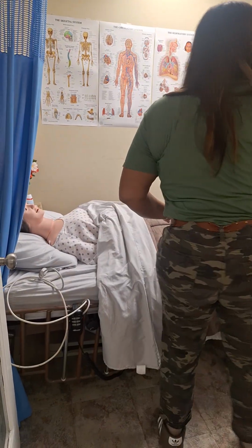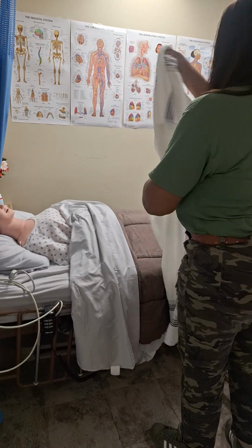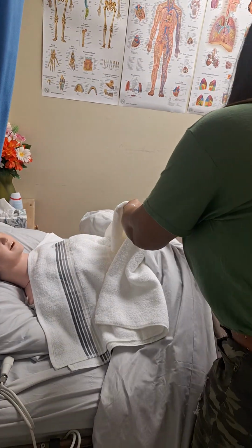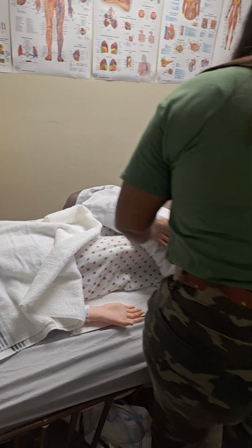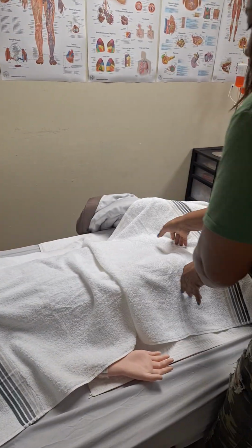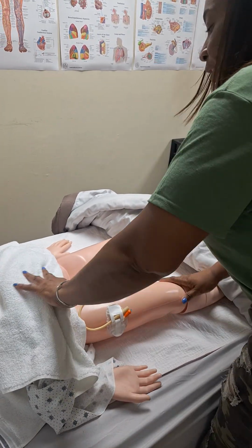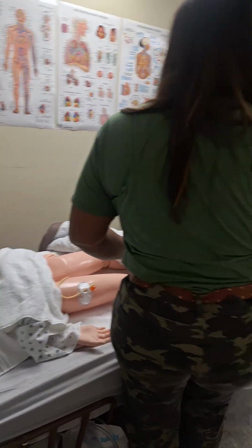So I'm going to put a warming barrier over Miss Allen. The first thing I'm going to do is cover Miss Allen up with a warming blanket. So I'm going to put the blanket over Miss Allen. I'm going to fan fold this down, only exposing what I'm going to wash. So I'm going to wash this, and I'm going to pull this down up under the cover. So now I'm only exposing the catheter because that's what the skill calls for me to do, catheter care. I'm just going to expose Miss Allen just enough that you can do the catheter care.